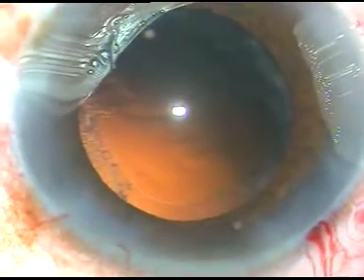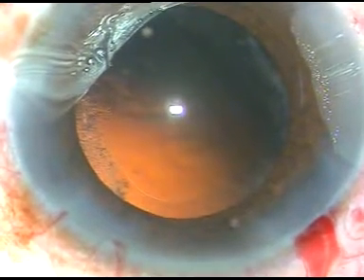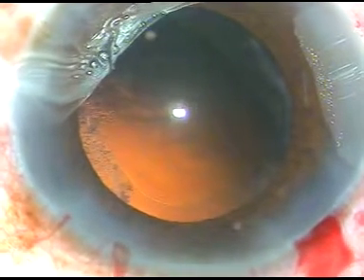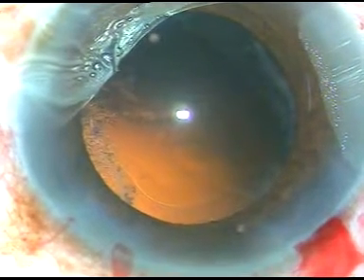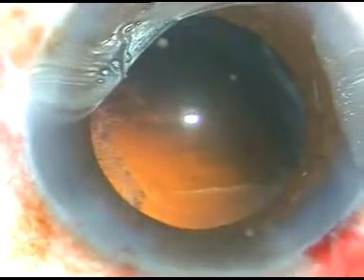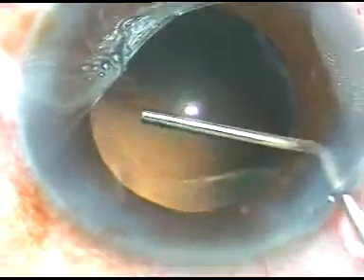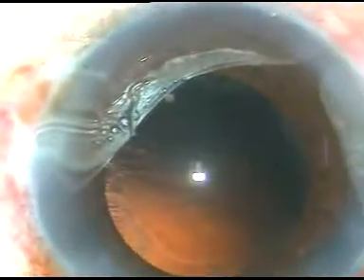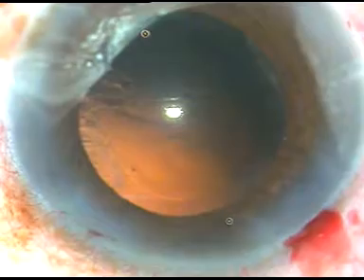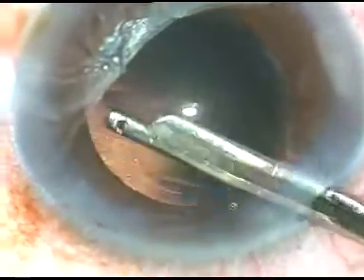This is what I learned from my guru, Dr. Subhash Haldipurkar: take the hydration or hydro-dissection cannula and irrigate the cells that are sticking to the posterior capsule at around 2 o'clock. We have to be very meticulous in surgery. I am irrigating these cells so that they become loose, and when I go again, they come out easily — and they do. I go back and the cells are coming now very easily.